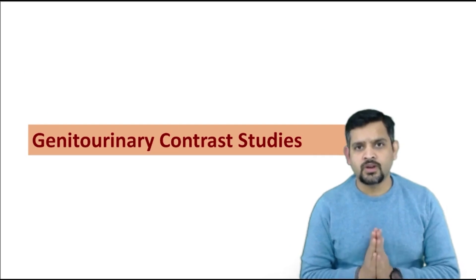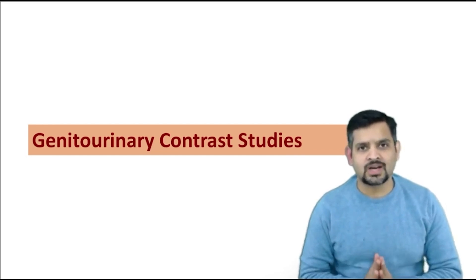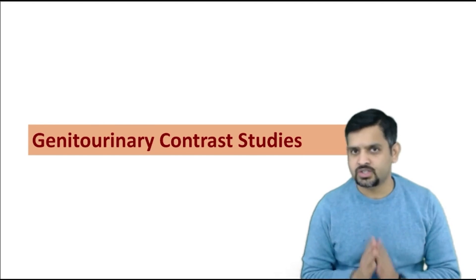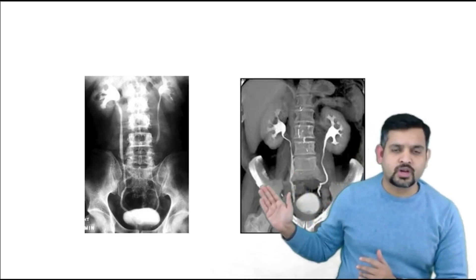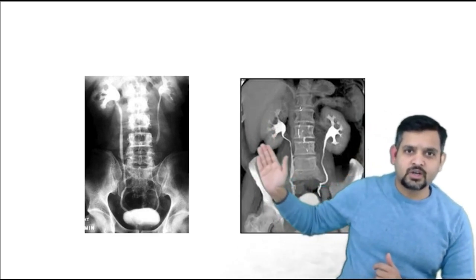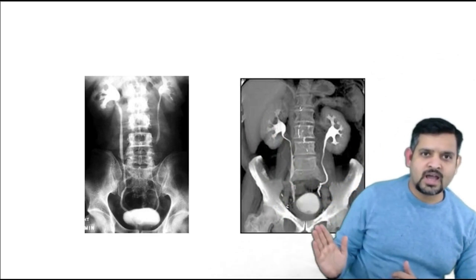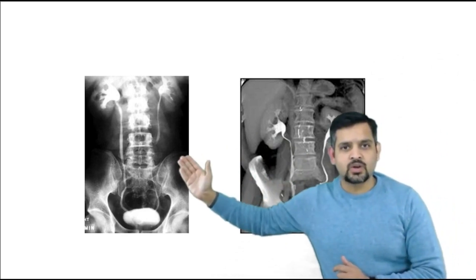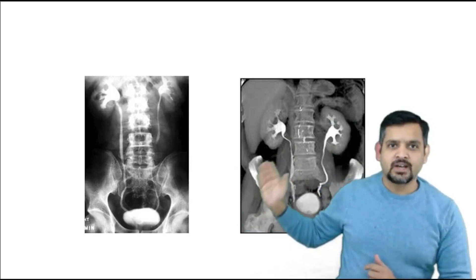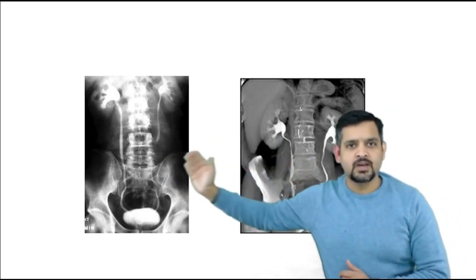In this video we will learn about important contrast studies used in the urinary system. If you see contrast going into the kidney, ureter, and bladder, this is intravenous urography. An important point to note: this is a radiograph — a conventional IVP — and this is a CT scan — a CT IVP.